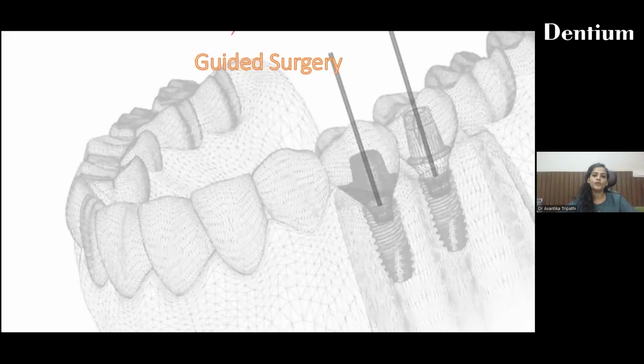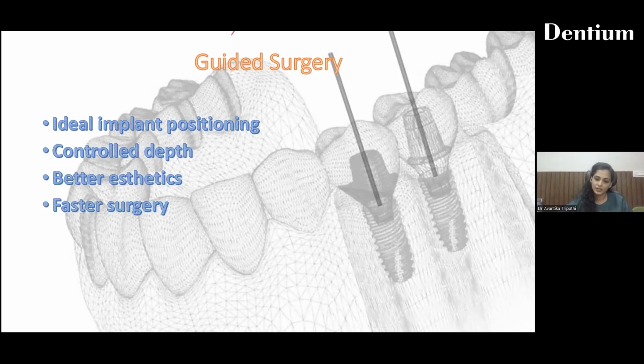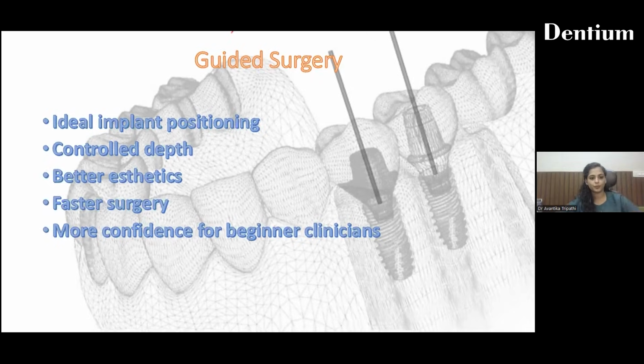But if we are going with guided surgery, we are going for ideal implant positioning. We are going for controlled depth. We are providing better aesthetics to the patient. We are doing the surgery way faster because we are not going to raise any flap. We are doing a flapless surgery, and it is very easy for beginner clinicians. Obviously, they should have a very good knowledge of guided surgery, how it is planned and how it is fabricated. But yes, it will become much easier for beginner clinicians.